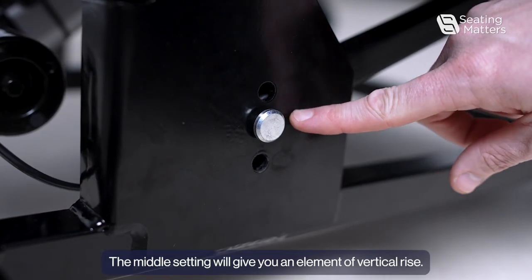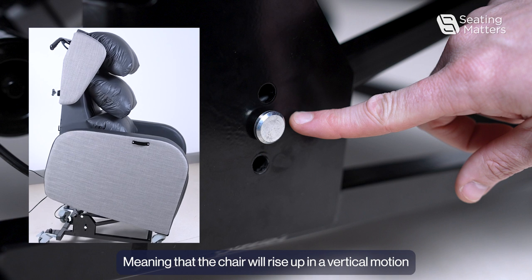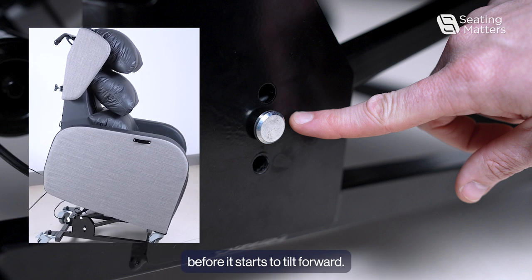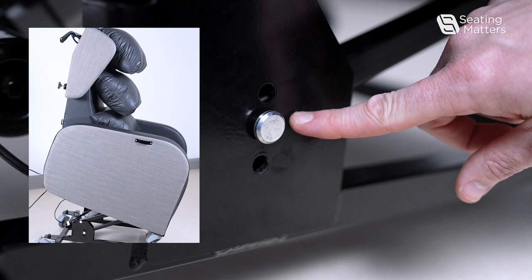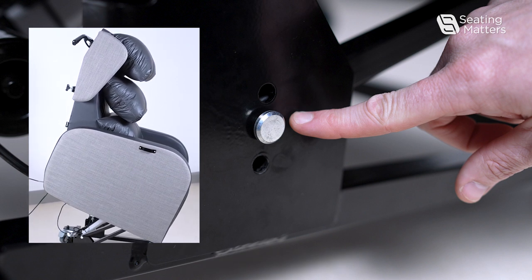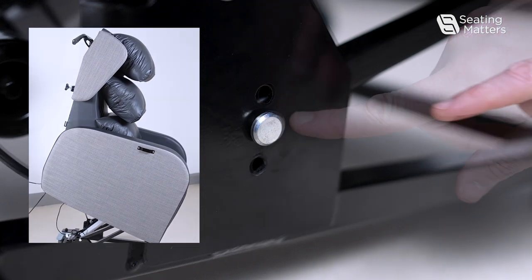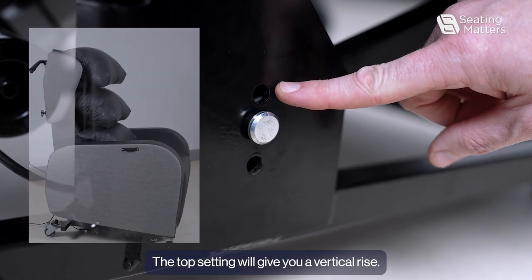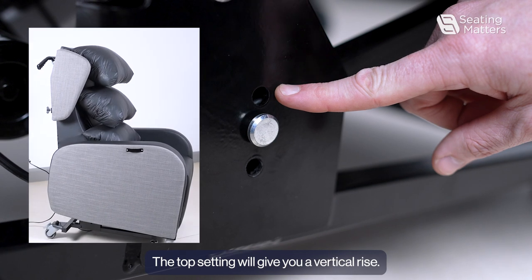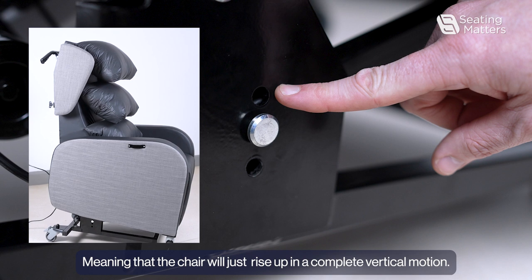The middle setting will give you an element of vertical rise, meaning that the chair will rise up in a vertical motion before it starts to tilt forward. The top setting will give you a vertical rise, meaning that the chair will just rise up in a complete vertical motion.